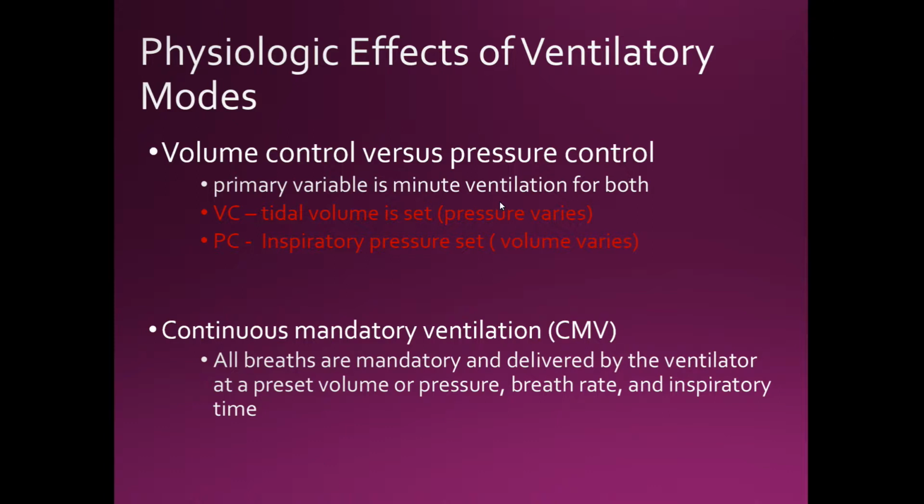That's very important because if you don't understand what mode you're in, you're not going to know what you're controlling. So on a CMV, or should I say assist control, all breaths are mandatory, which means the machine is doing all the work, and they deliver the breath at the volume or pressure that you set.